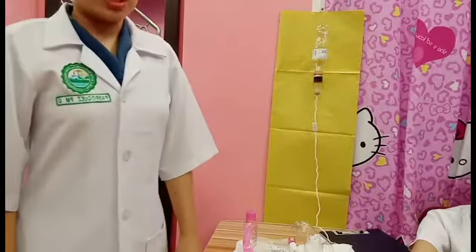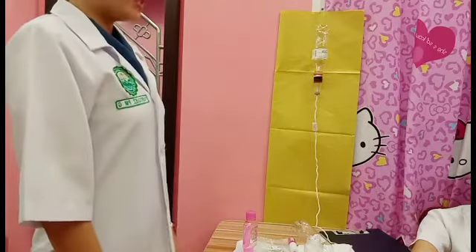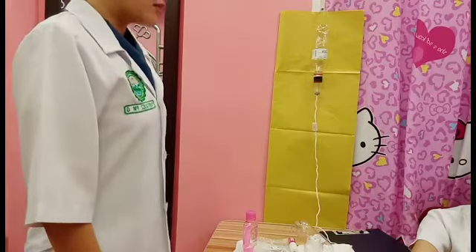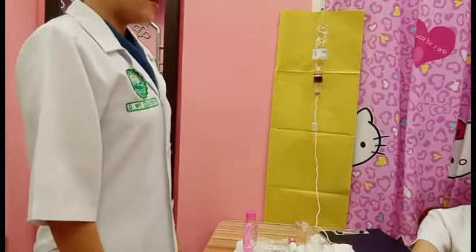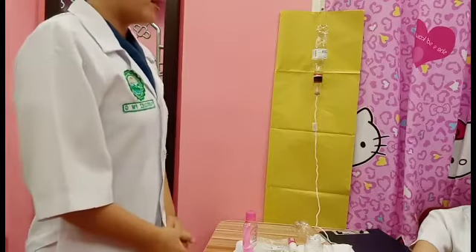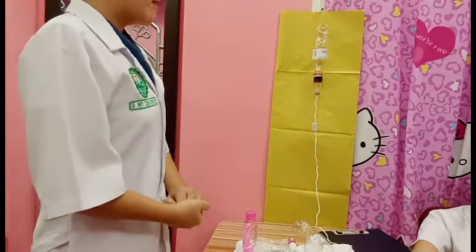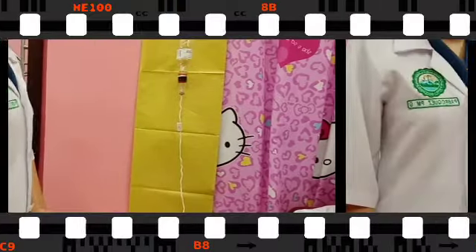So for the implementation, we need to explain procedure to the client. So magandang umaga po, ma'am. Ako po si Perlin Pabroques, isang student nurse. May I know your name, ma'am? Marie Chris Gomez. So magandang umaga, Miss Marquis. So ngayon po, ma'am, kailangan po natin i-change yung solution nyo or yung IV fluid nyo dahil according po sa inyong doktor ay kailangan pa po ito i-continue.